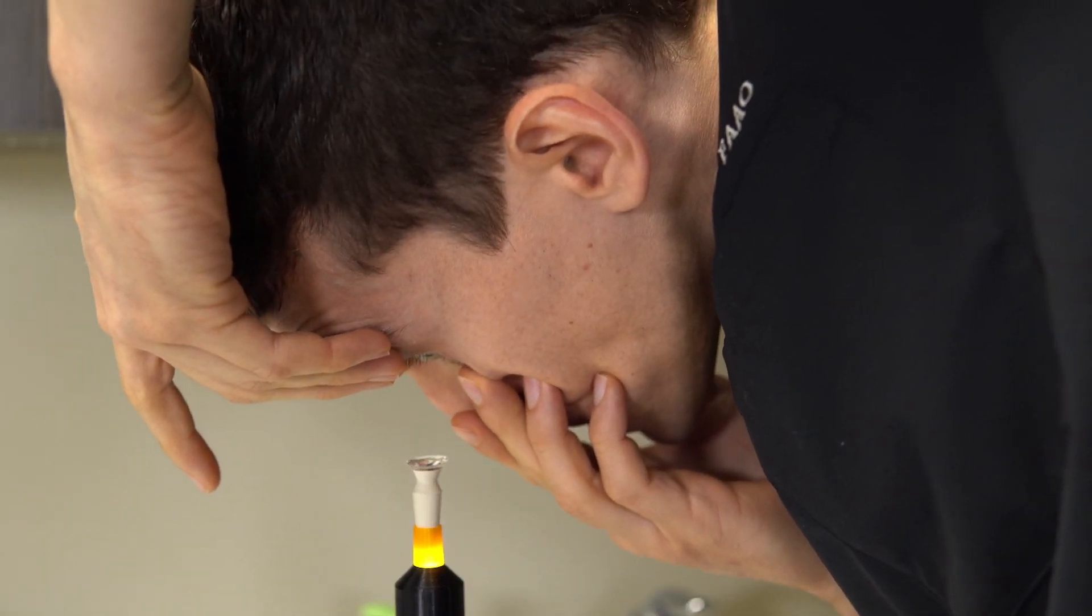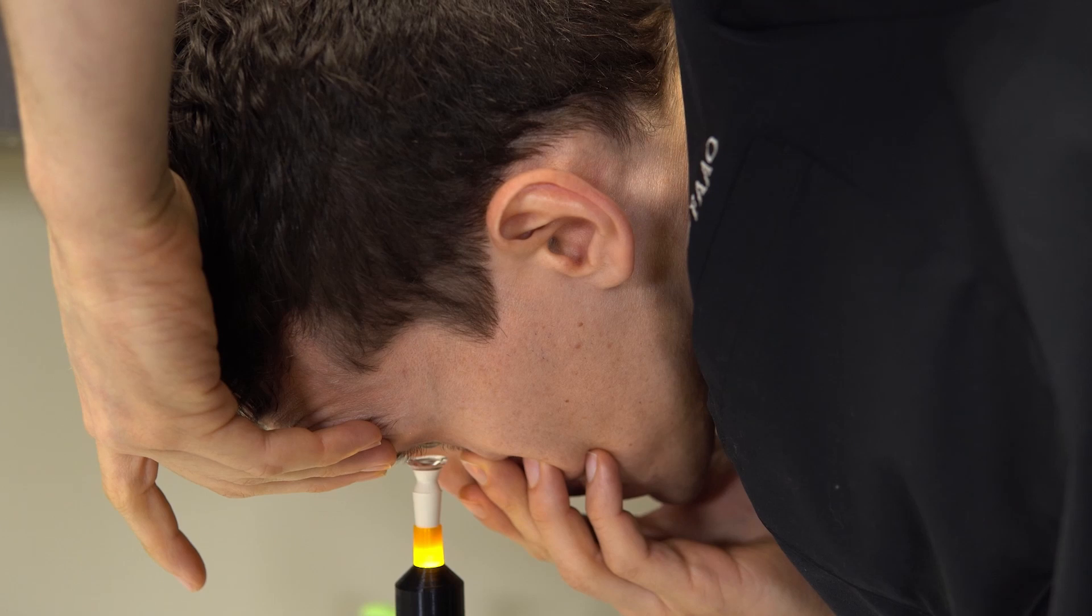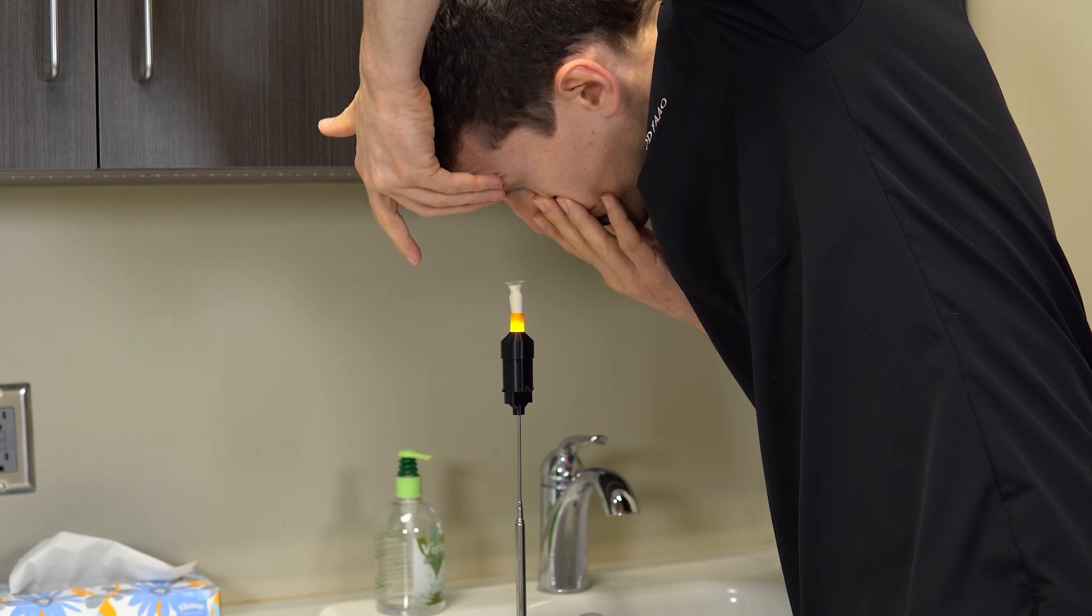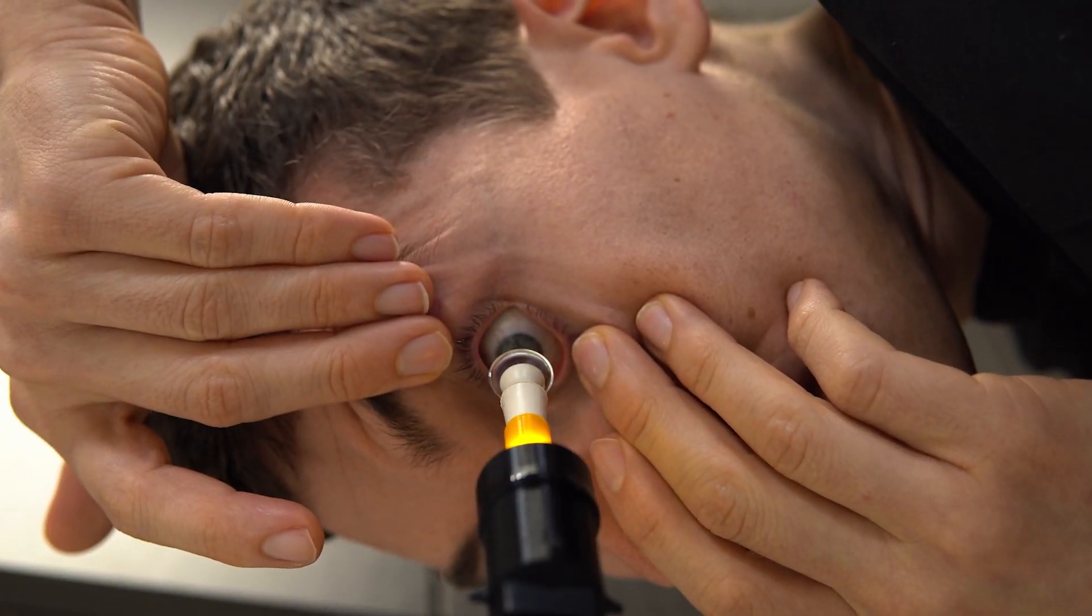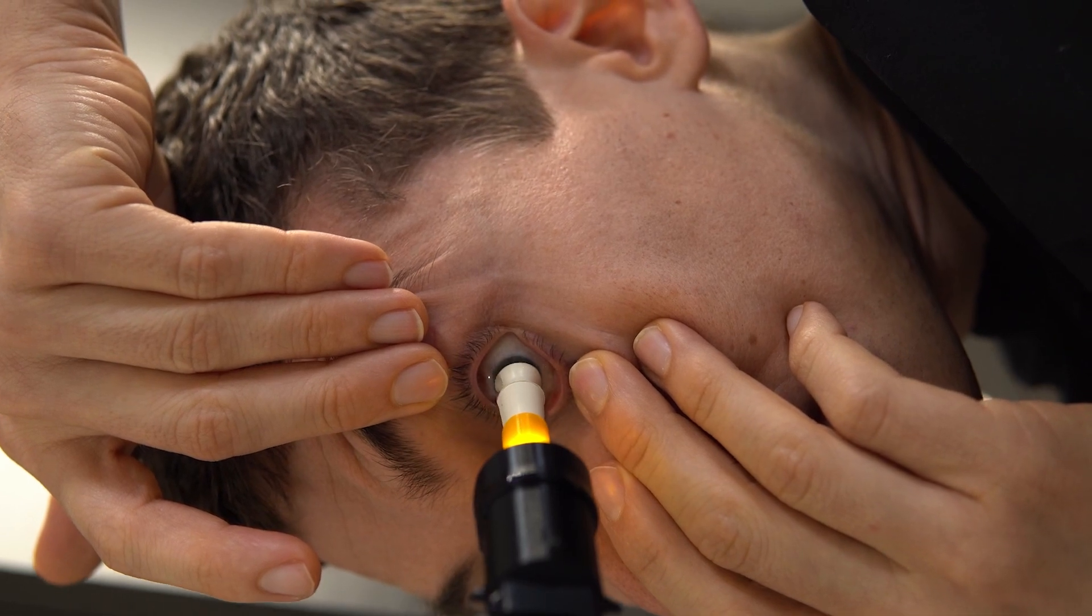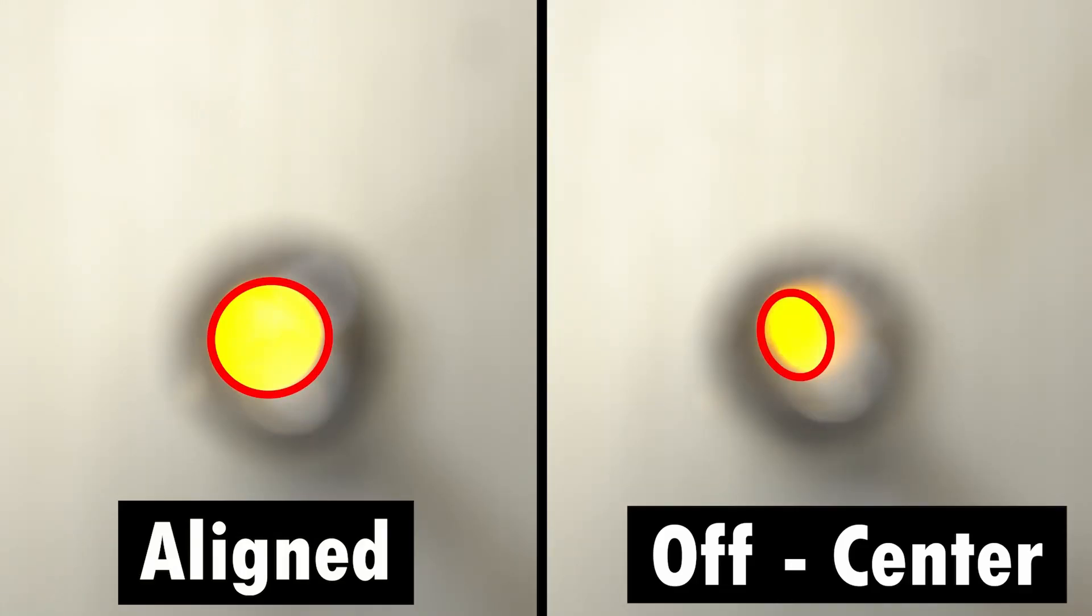Step three: keep both eyes open and slowly move your head down toward the lens until your eye makes contact with the saline solution in the lens. A pro tip here is to focus on the light as you move closer to the lens. The light will look perfectly round if you are lined up with the center of the lens. If the light does not look round, you need to adjust the position of your head until it does.